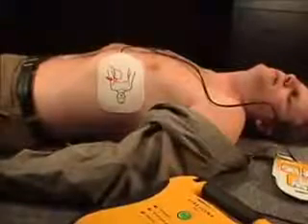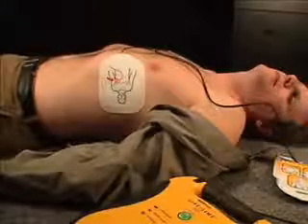Press the flashing shock button to deliver shock one. Shock one delivered. It is safe to touch the patient. Begin CPR now.